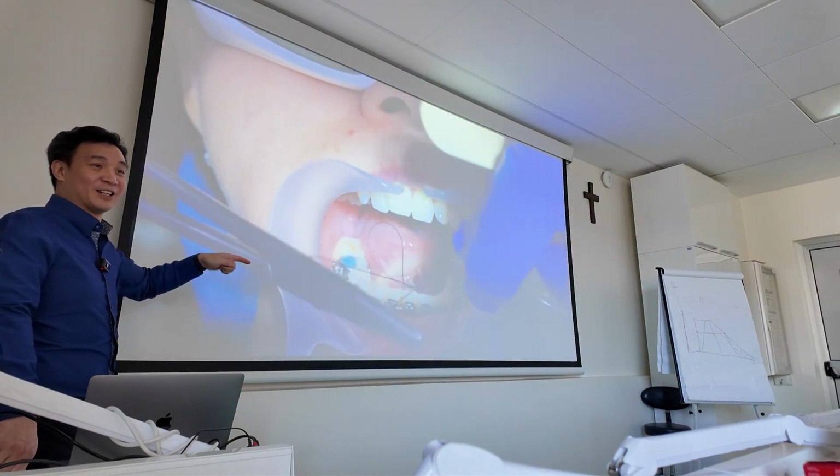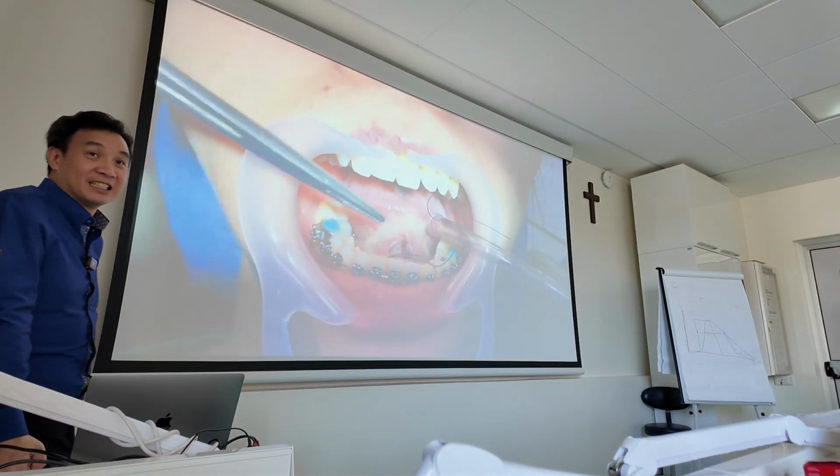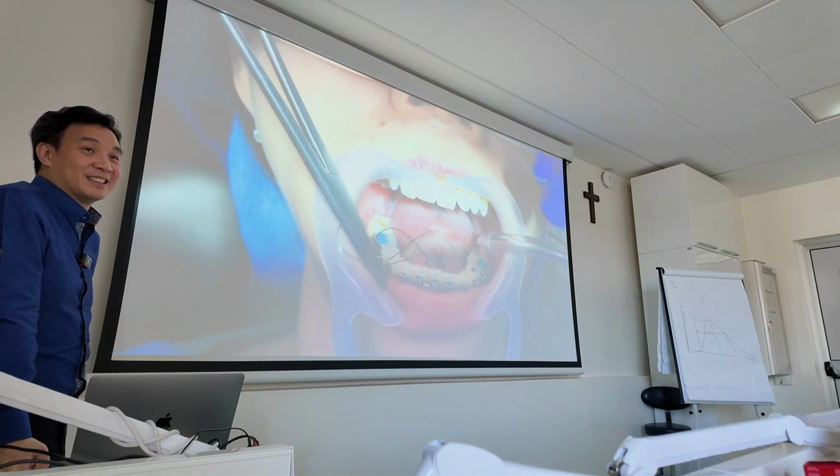Because if you cut right now, it's going to bleed. So the middle is the vessel. Do you see that? Yeah, but I hardly see this.